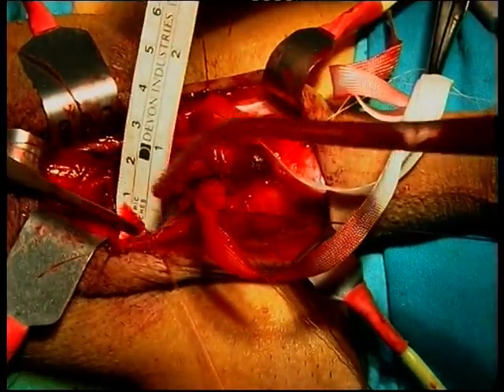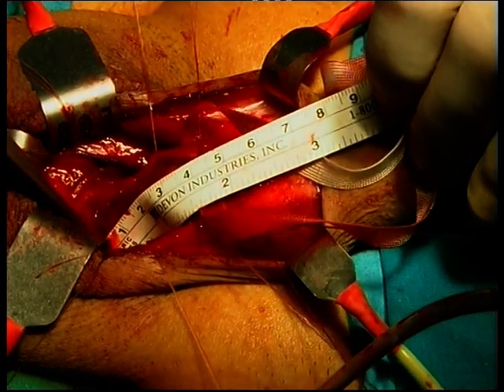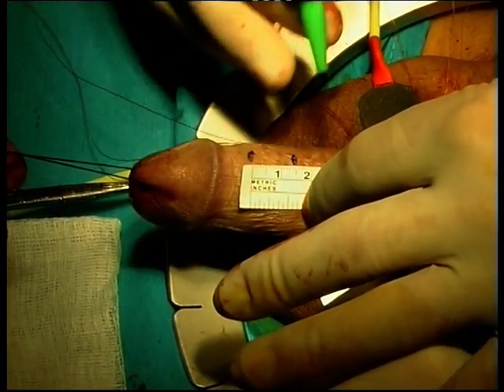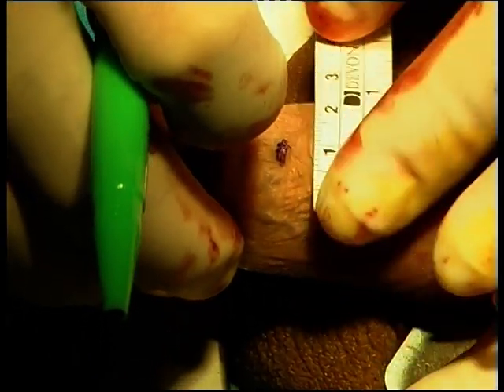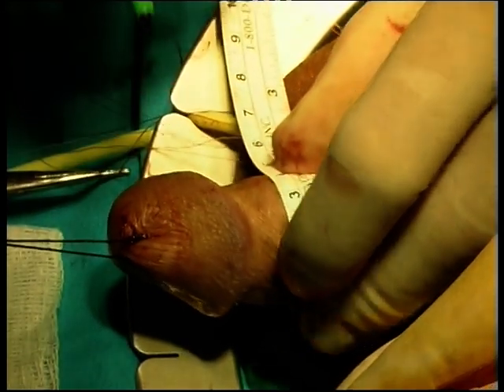Thereafter we measure the length of the stenosis and the diameter at its narrowest side, which are 5 and 1 cm respectively. We draw the shape of the graft on the preputial mucosa, which is 5 cm long and 1.5 to 2 cm wide, in order to obtain a urethral diameter of 25 Charriere.